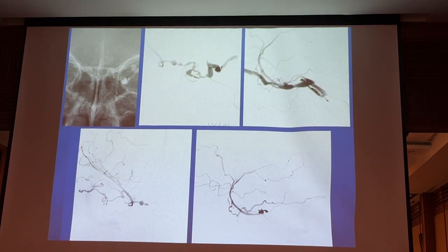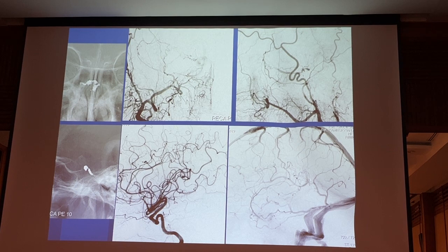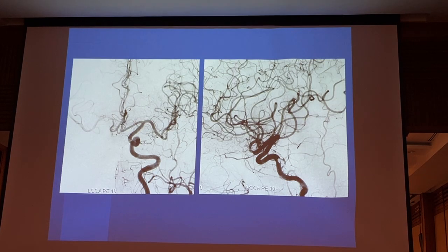So we struggled, and eventually were able to go into the coronary sinus and go to the opposite side of the cavernous sinus. You can see the very small channel. So we were able to close it, and this shunt was closed successfully without going to surgery on this specific woman.